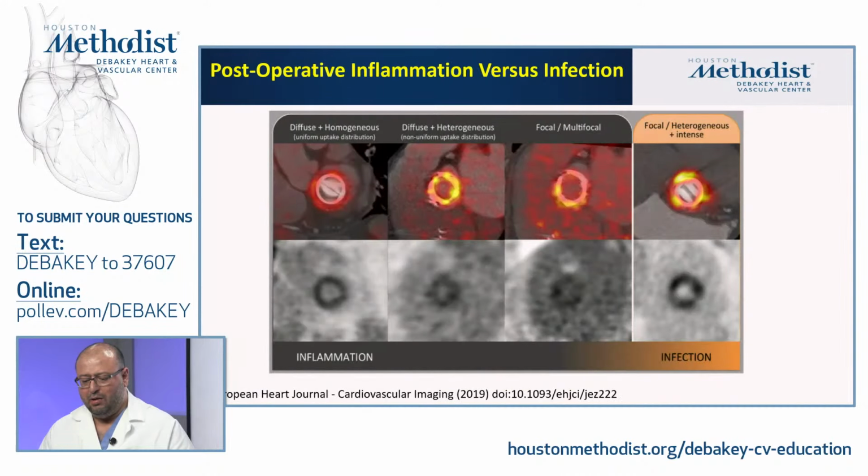So we are always dealing with a spectrum, and it is more of a consult when we are looking at this. It's very helpful to look at multi-modality approaches. If there is a CT, it is very essential to also look at the echocardiogram and try to correlate where we see the FDG uptake with how the images look.